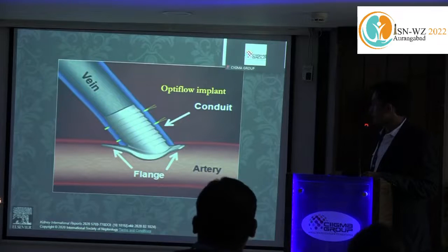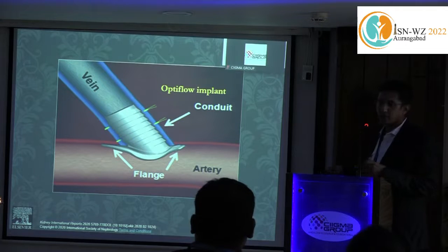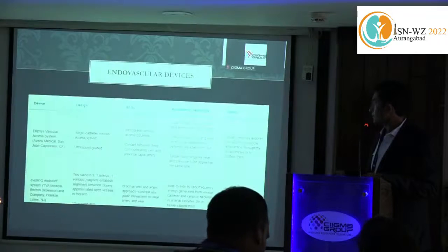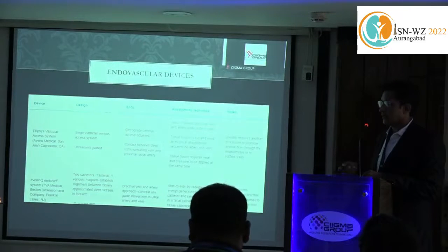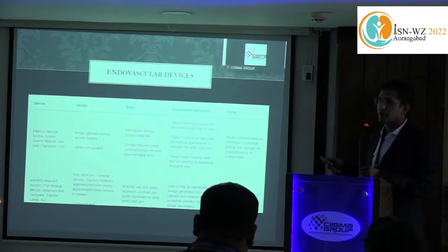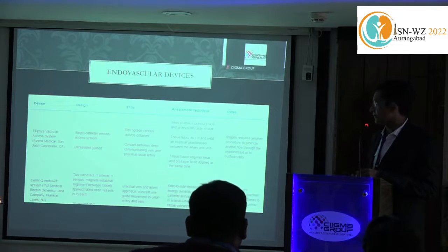Another device being reported is the OptiFlow implant. This is a conduit, but obviously I don't think it's available in India at present. These are open surgeries, and the day is not far when we will have interventional AV fistula creation.